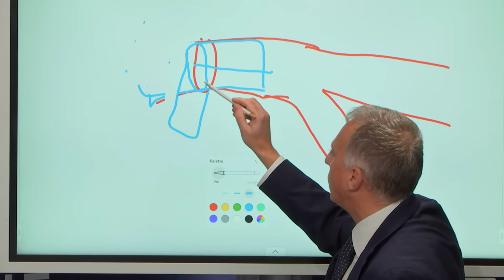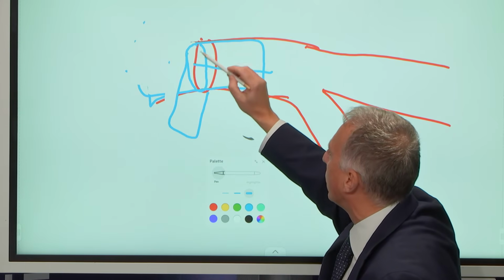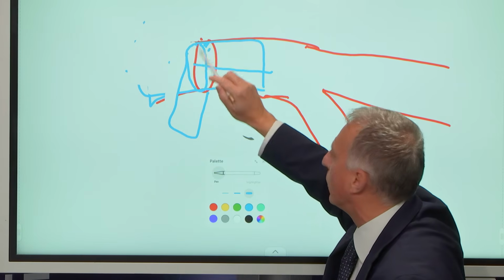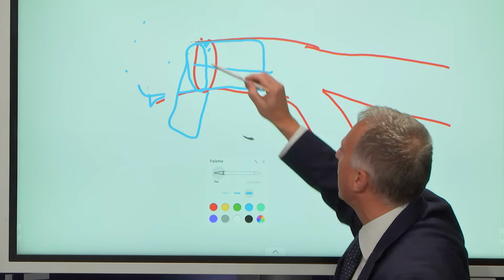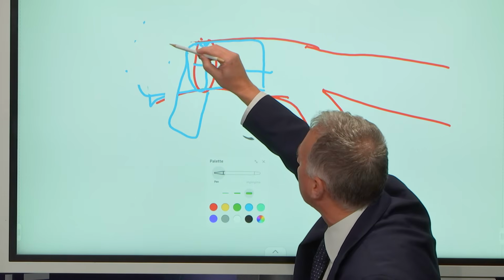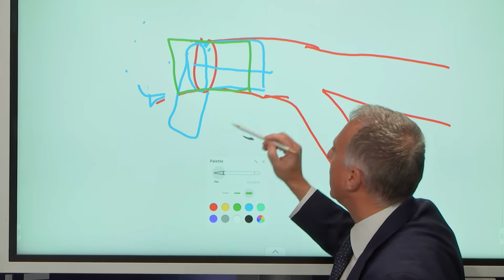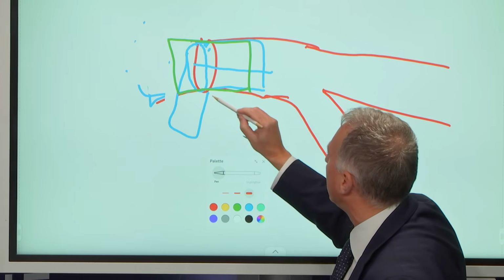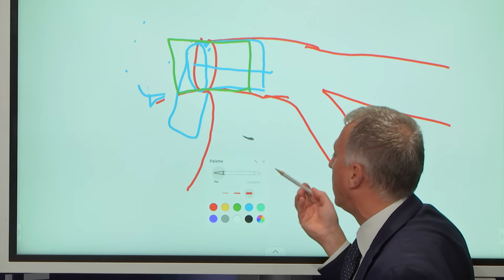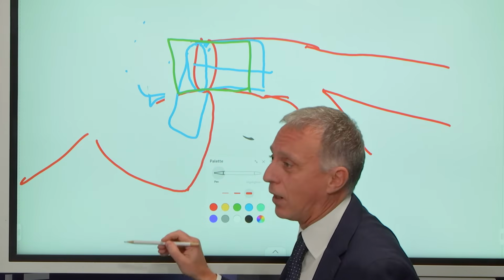All the time you do like that, it makes sense to be sure that you fix the ostium, because in doing this, it is possible that you do not cover part because you remove the stent. So you need really to add a final stent here to be sure that you cover. Honestly, the main concern is related not with the coronary artery, because this crushed stent probably is tolerable, but here, in most of the patients, we have the aortic valve.